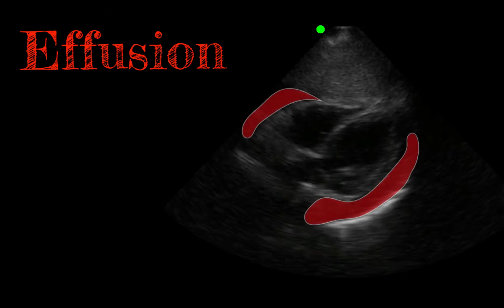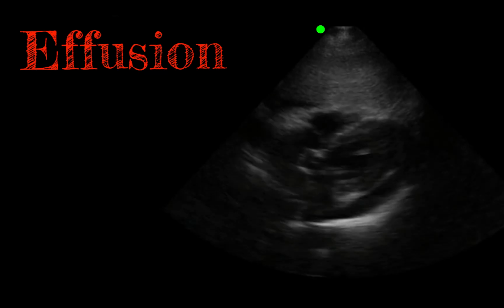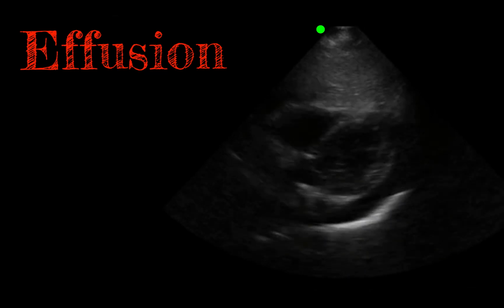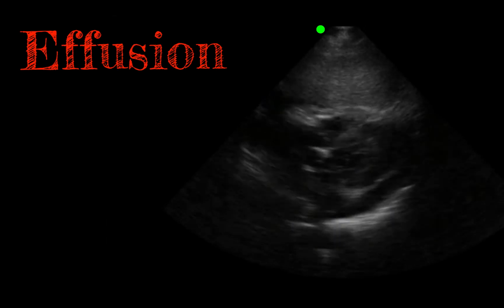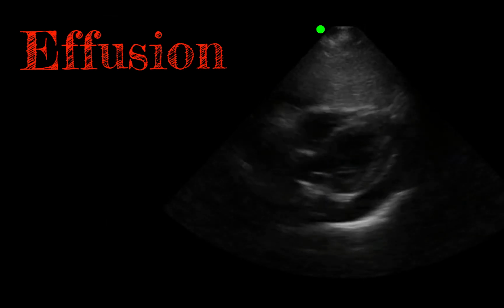Remember that just like with abdominal fluid, free fluid in the setting of trauma, especially penetrating trauma, should be presumed to be blood, but in the setting of a medical patient, this can be uremic, infectious, malignant, or inflammatory, which might change your management. Once you've identified the free fluid, take a close look at the way the right ventricular free wall closest to the near field is moving, and watch for collapse of the wall and the right ventricle during diastole, which would represent obstructive impending shock due to tamponade.